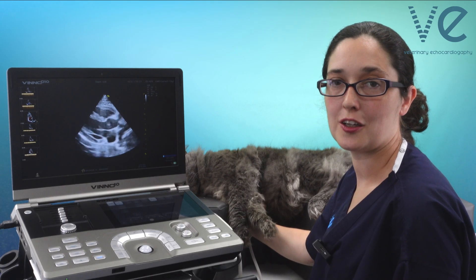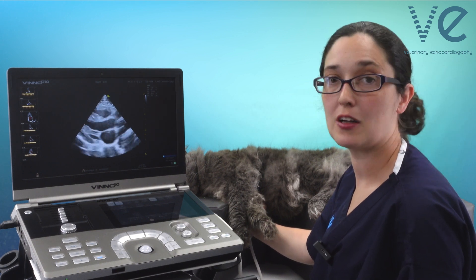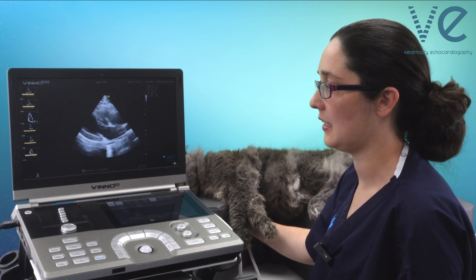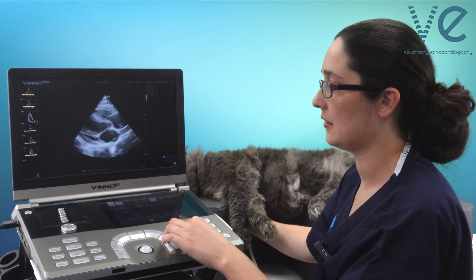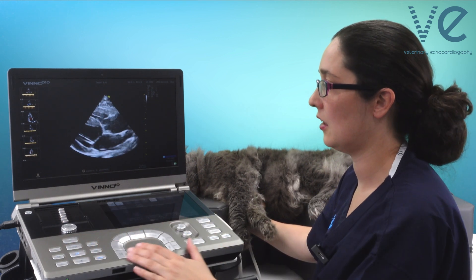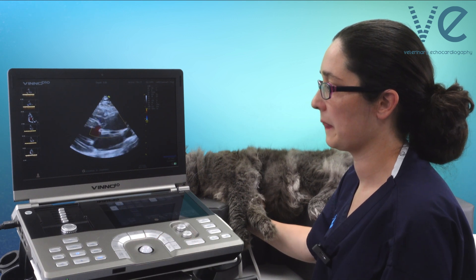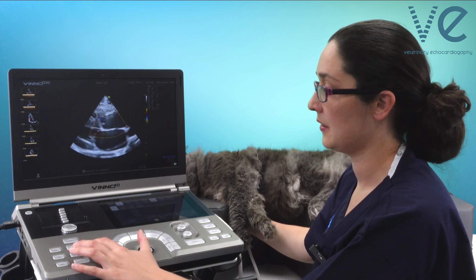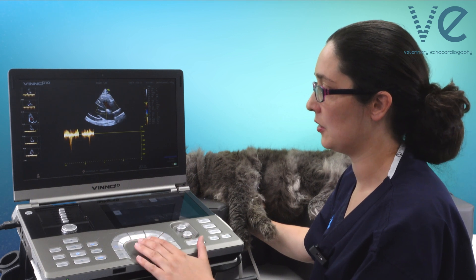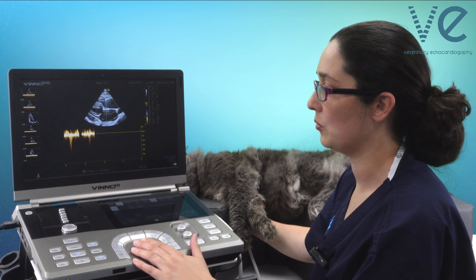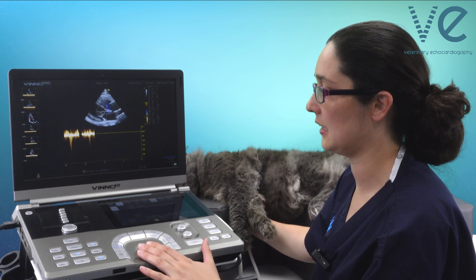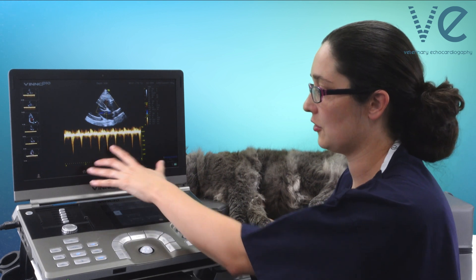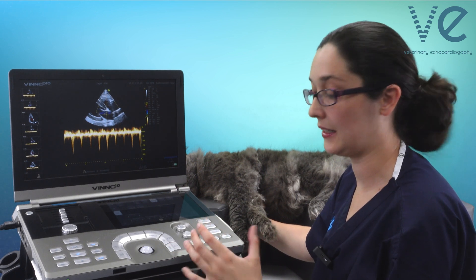My goal here is to get the tricuspid regurgitation jet from any view that I can. From my right parasternal long axis view, I'm going to turn it into a four chamber so I can see the tricuspid valve more clearly. I'll put colour over the tricuspid valve and I can see a little bit of a jet — not very significant regurgitation, but it's enough to try and get a trace. With my continuous wave Doppler, I'm going to align that as best I can with the direction of the regurgitant jet. I'm getting a partial trace here — just a little spike — because I'm missing most of it. So there must be another view I can get this better in.